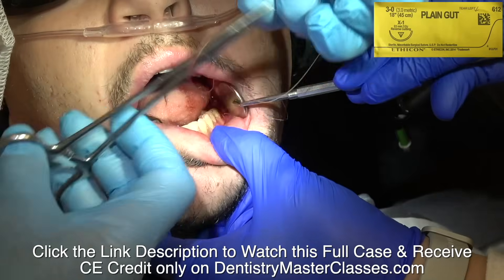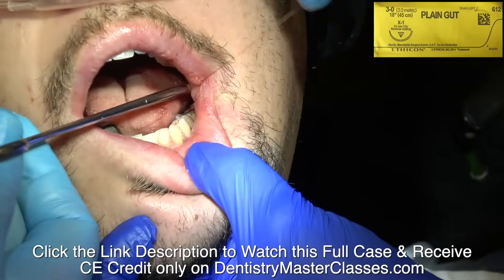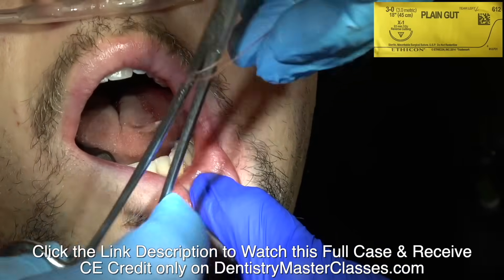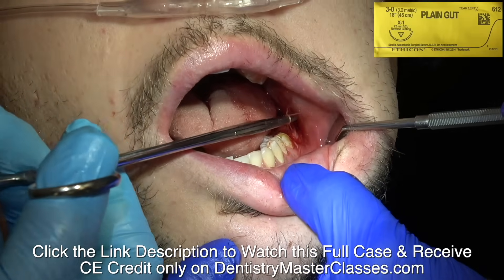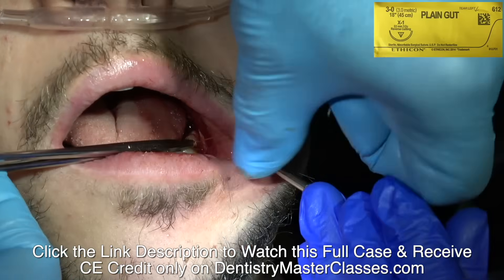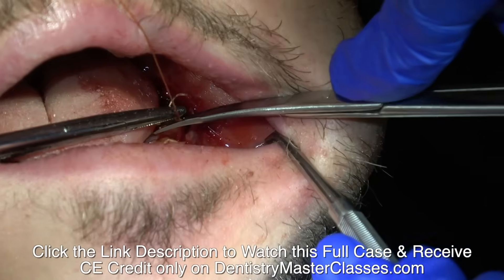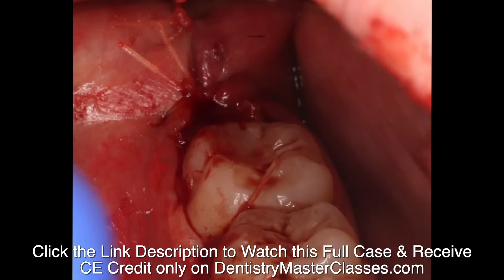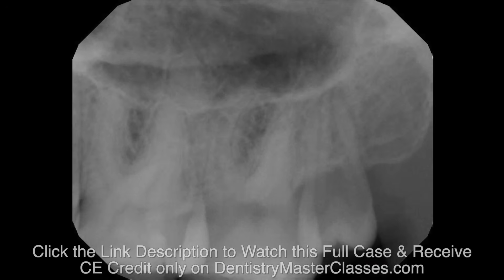You don't want to do these kinds of surgeries without a very good assistant that knows what they're doing. You wouldn't begin to do this without an assistant, and I wouldn't want to do it without one that was experienced and really knew what they were doing. So there it is, sutured tight. Now we're going to extract the upper wisdom tooth.